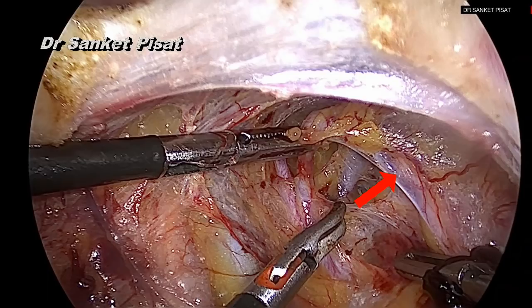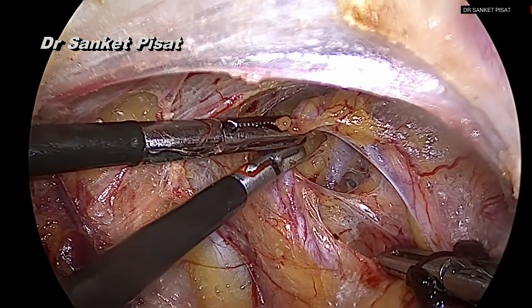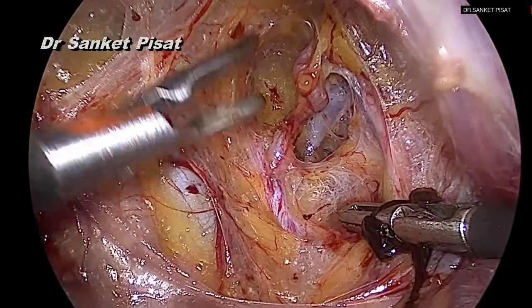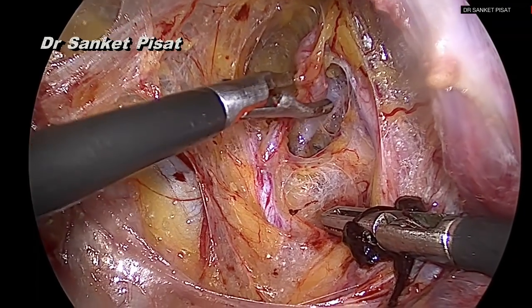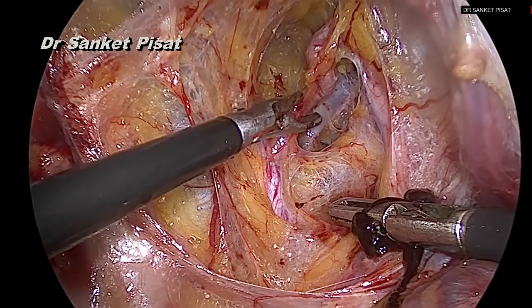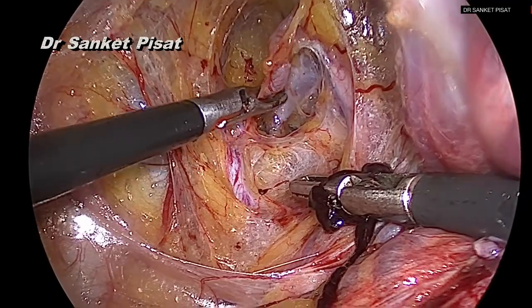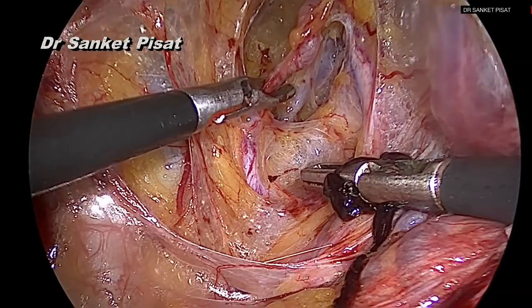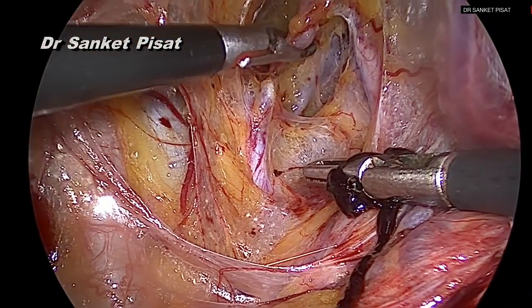Once this is done, the uterine artery has been dissected completely and can be ligated using any means required. The uterine artery is lifted away from the surrounding structures, making sure that the ureter is away and the uterine vein will not get injured, and after that it can either be coagulated using bipolar current, or one may pass a ligature around it or put clips at the uterine artery. Any of these methods is equally and perfectly safe so long as the ureter is in view and out of harm's way.